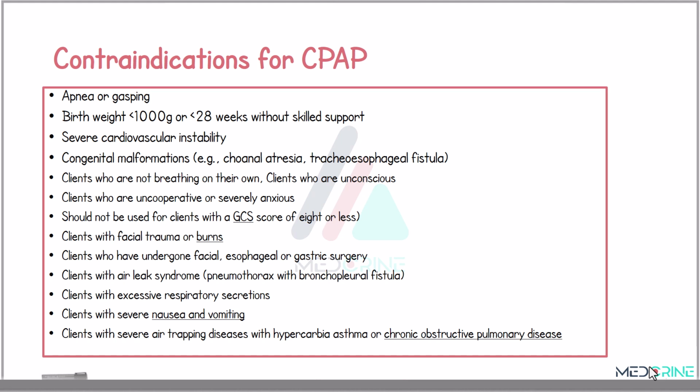It is contraindicated in clients with facial trauma or burns, clients who have undergone facial, esophageal or gastric surgeries, those clients with air leak syndrome, for example, patients with pneumothorax or bronchopleural fistula, those with excessive respiratory secretions, severe nausea and vomiting, and clients with severe air-trapping diseases with hypercapnia, for example, asthma or chronic obstructive pulmonary disease.